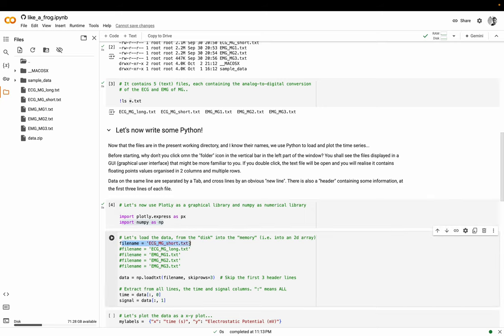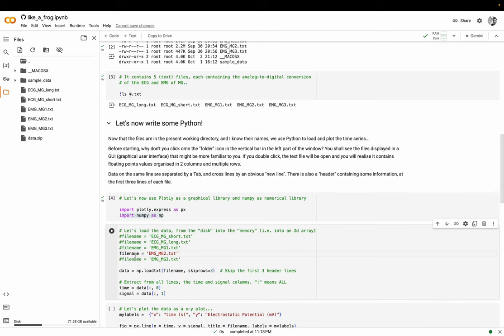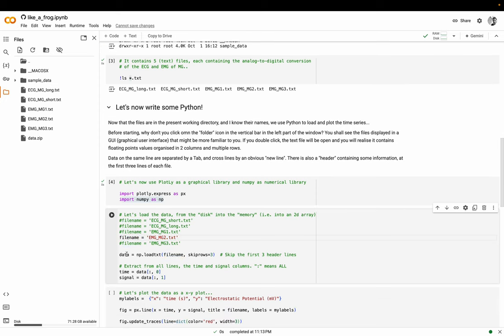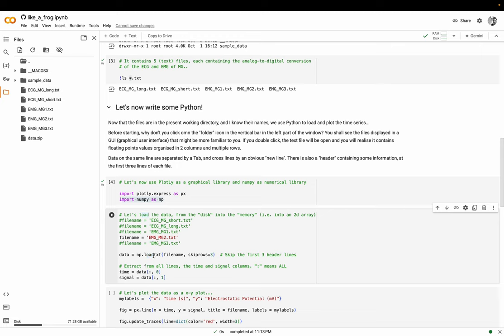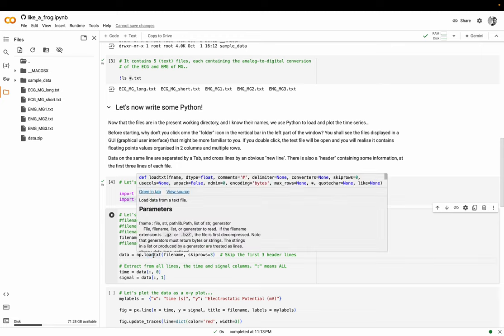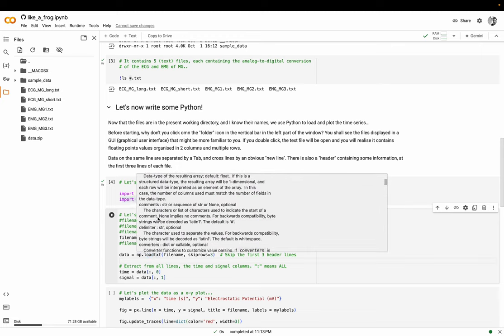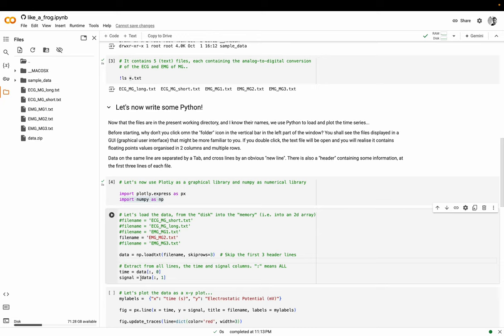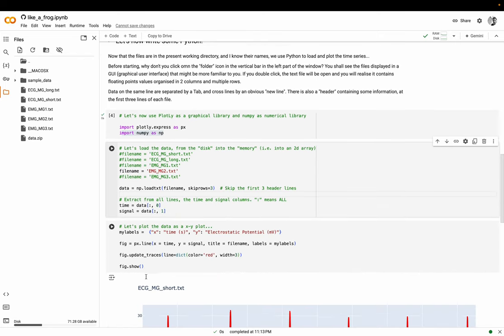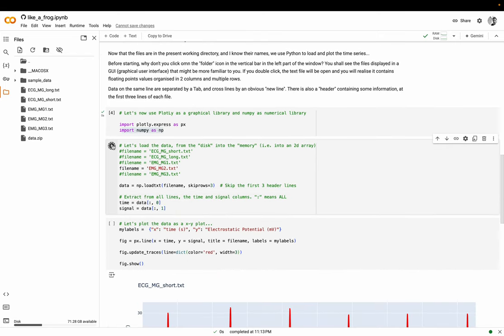All the others are commented. If I don't like this one, I can put a comment here and uncomment another one. You see here it's basically using a command from the library numpy to load a text file. If you put your mouse here you will get some help on what this function is doing. I want it to read the file name and skip the first three rows. Then, being this one a two-dimensional array, I just want to have two vectors - one for the times and one for the signal, the electrostatic potential that I recorded from my heart. I execute it and you see it's very fast.